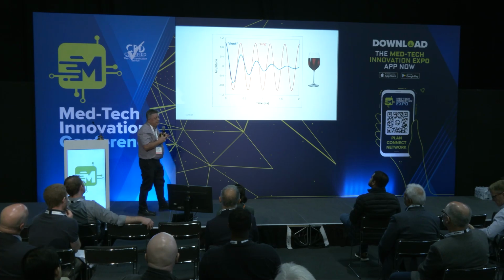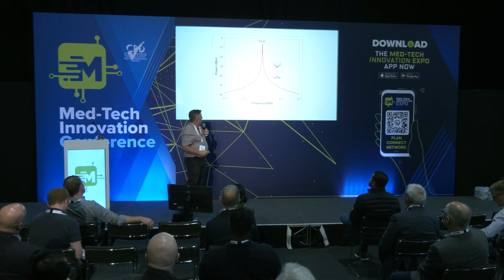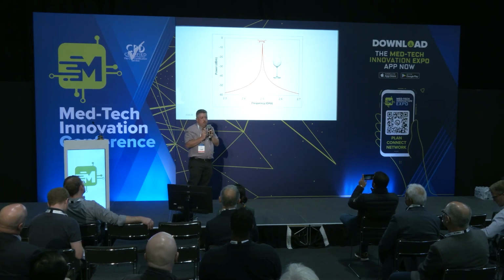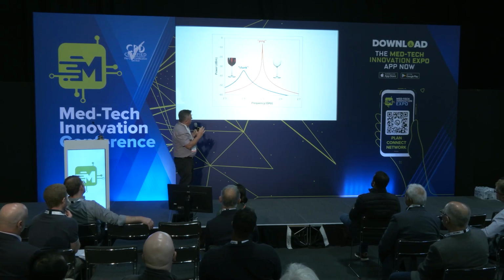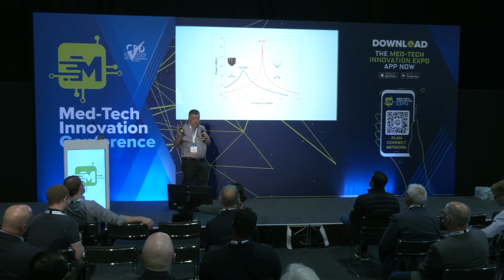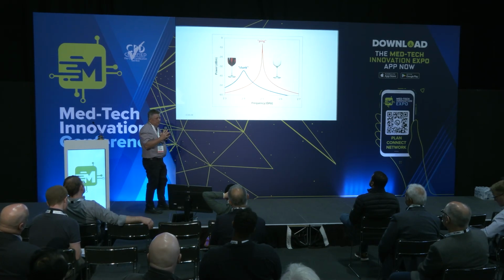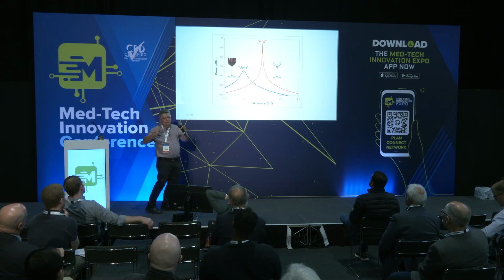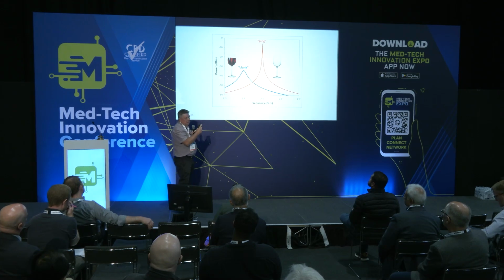And we don't look at things in this so-called time domain. We do something called a Fourier transform of this and look at things in the frequency domain. So if you look at the ping in the frequency domain, you have this really sharp resonance. But if you damp it, the clunk looks like that blue trace. So two things happen. One is you get a shift downwards in resonant frequency, and you can hear that with the bell, can't you? Because it rings at a lower frequency. The other thing, though, you notice the width, the spectral width or the bandwidth increases as well. So there's two bits of information for us there that tell us about the thing that is causing the damping.